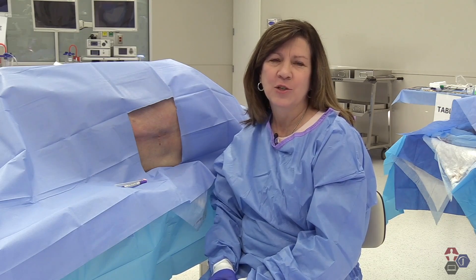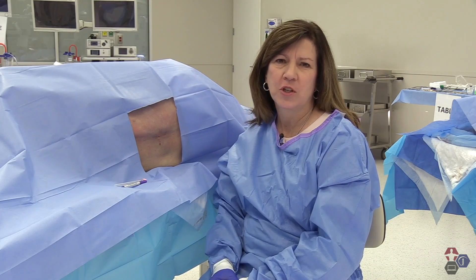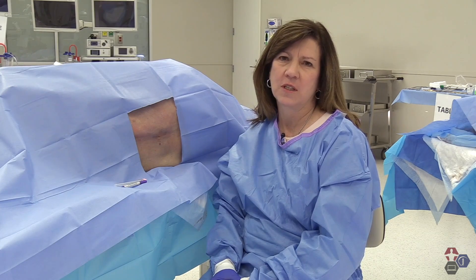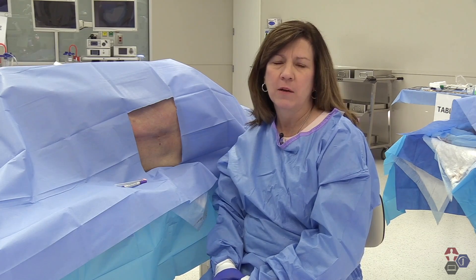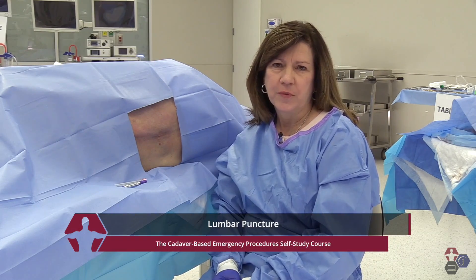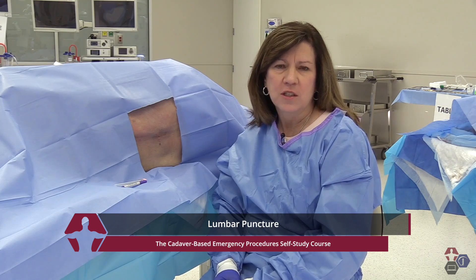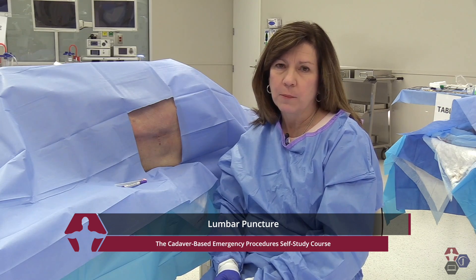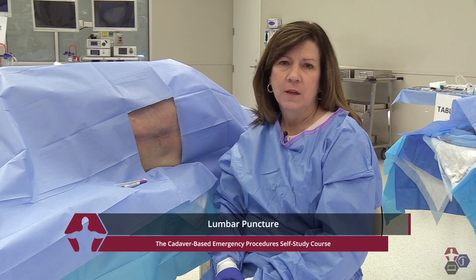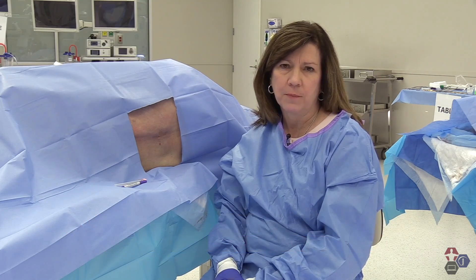Hello, I'm Dr. Joan Kolodzik, National Director of Continuing Medical Education for US Acute Care Solutions. Today I'm going to be talking about lumbar puncture. We're going to talk about the indications, contraindications, complications, equipment, the anatomy, and then the procedure step by step.